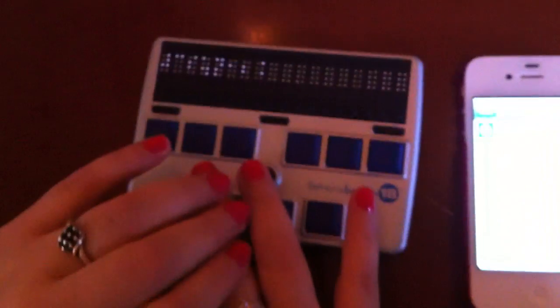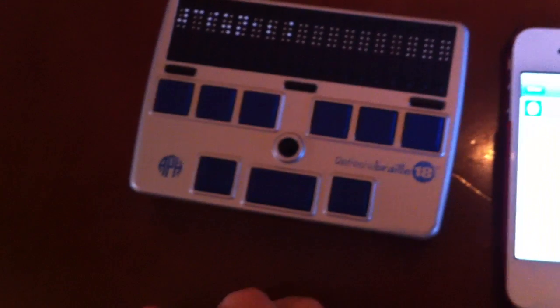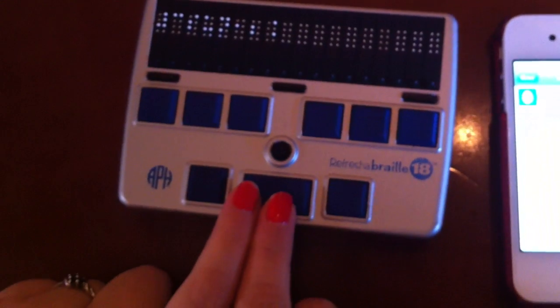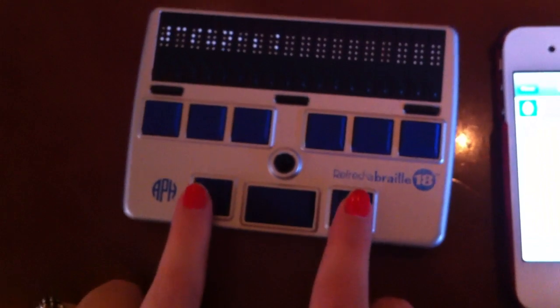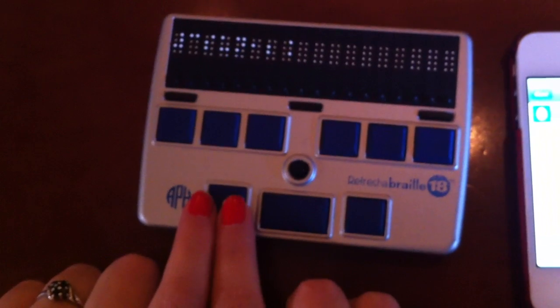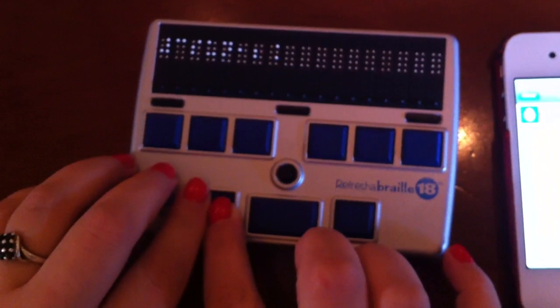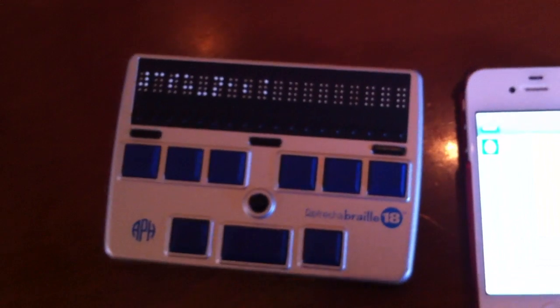That is so cool. I have not actually ever seen one of these work. I've heard about them, but it's hard to wrap your head around it before you can see it. So what are these 3 buttons across the very bottom? This is a space bar. Okay. And these are 2 function keys. These help do different commands, like when I want to make a capital sign, when I have it in a certain computer braille mode, I hold down this button and then press a letter to make a cap. So it's a little bit like a shift. Or dot 7. Yeah, it's a little bit like a shift, but they're different function keys to help do different commands.